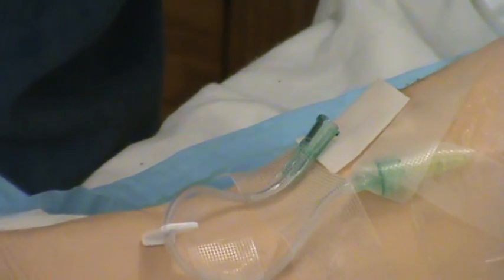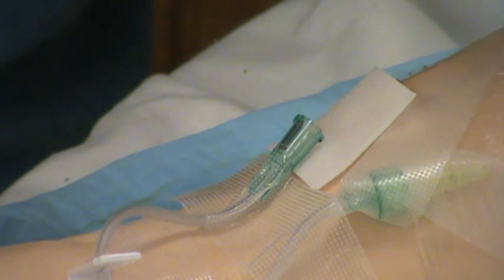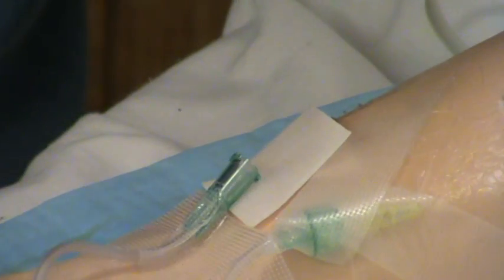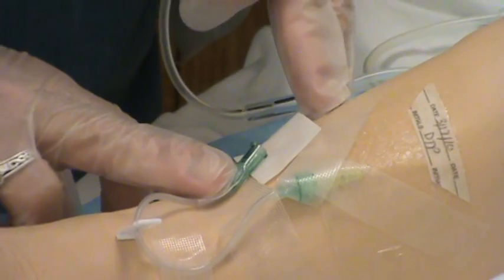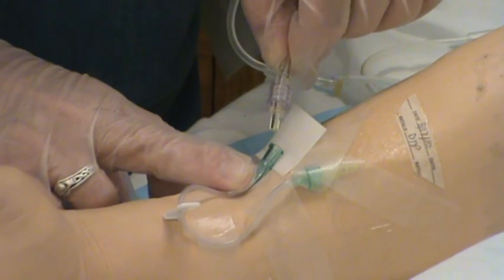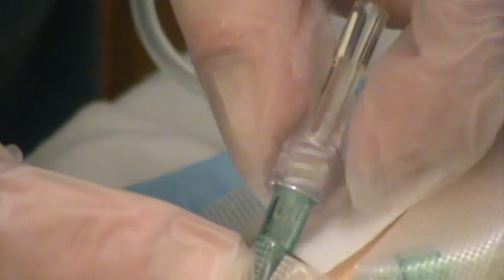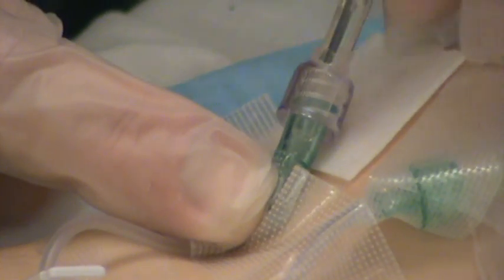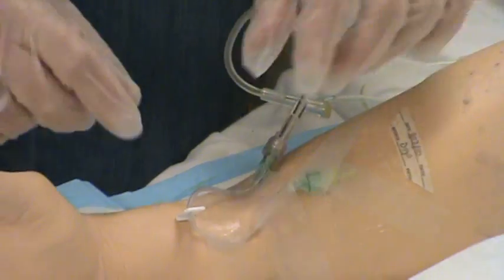Now, got my new system here. This needs to remain sterile. I'm going to take the blue cap off, lay that there. This is clamped so it won't run all over the place. I'm going to put it into the hub here after swabbing the hub, just to make sure that it's clean. All right, that's swabbed, and this is coming in. Then I'm going to slide this down and screw that on, and that's in place.